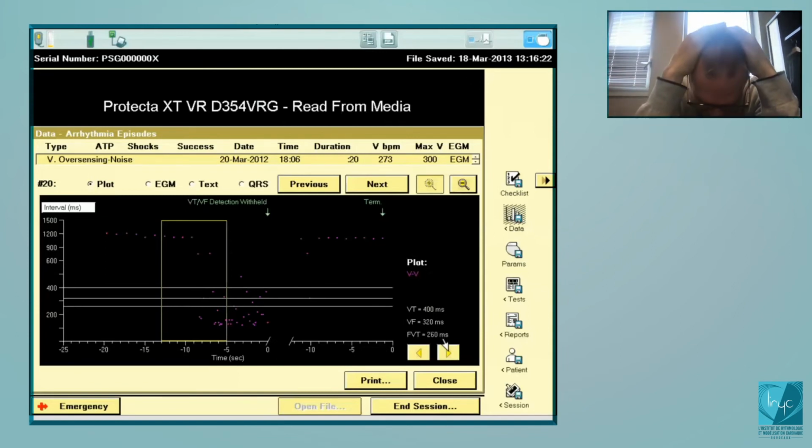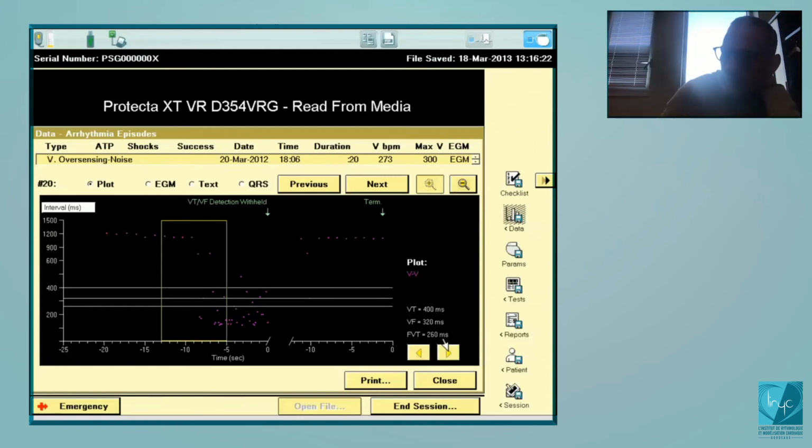The short VV interval counters, at the level of the blanking this time. If you program a blanking of 120 milliseconds, a short cycle is a cycle of 130 or 120 milliseconds. If you have 30 of these short cycles in one day on 3 consecutive days, then it's also going to be a positive factor. So you need 2 out of the 3: abnormal value of impedance, short cycles at the level of the blanking, or 2 episodes of non-sustained VT.